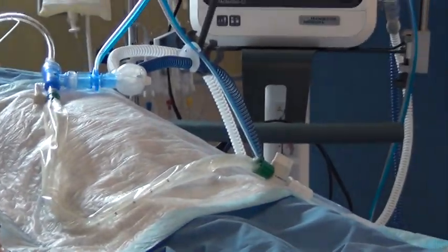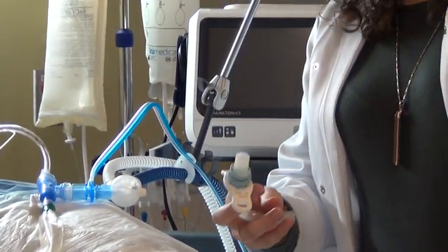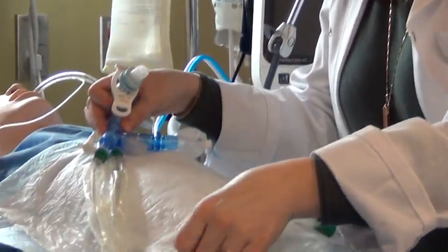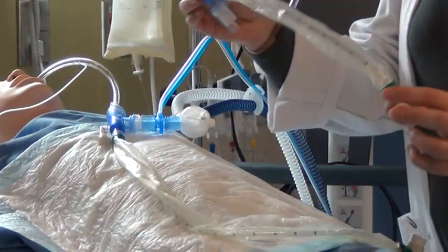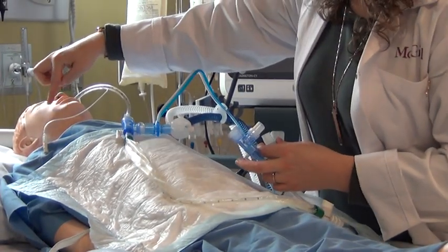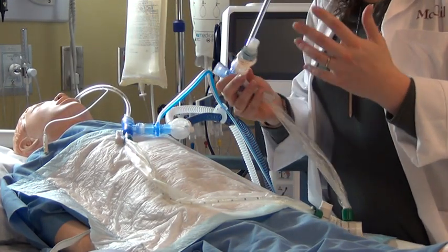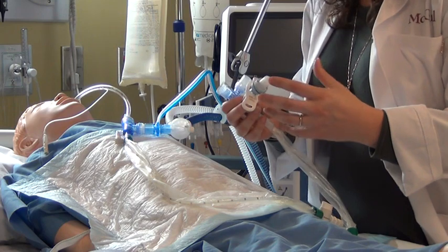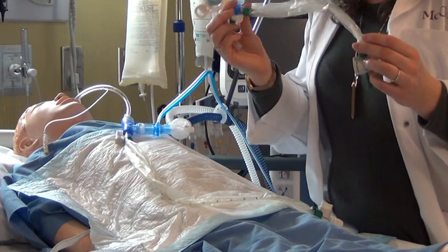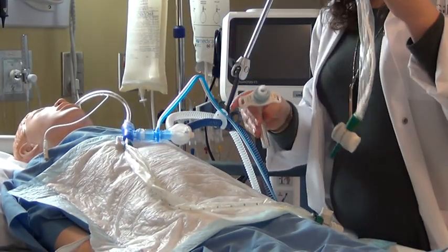Now, if your patient were to have a tracheostomy instead of an endotracheal tube, there are smaller inline suctions. As you can see here, the length is very different. With the tracheostomy, the purpose is that it actually removes the dead space from the mouth all the way to where the tracheostomy is placed. Dead space is a space in our body that is not used for gas exchange. And so therefore we don't have to go as deep because we've already kind of removed that distance, hence why it's much shorter.